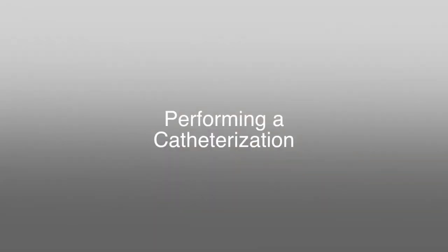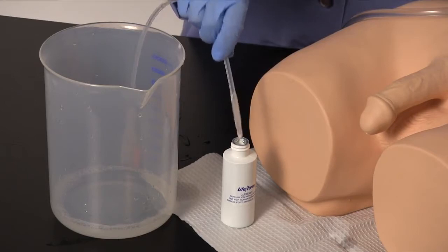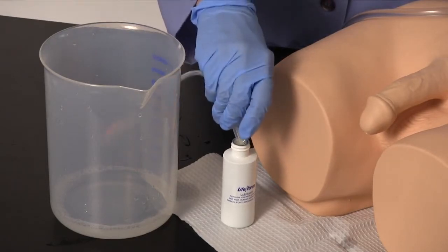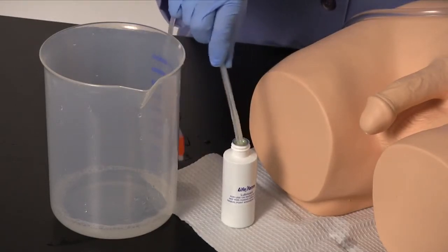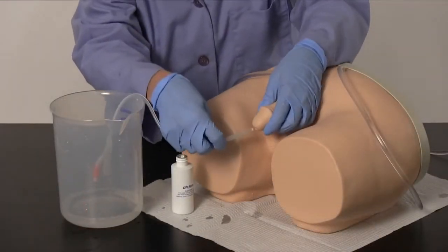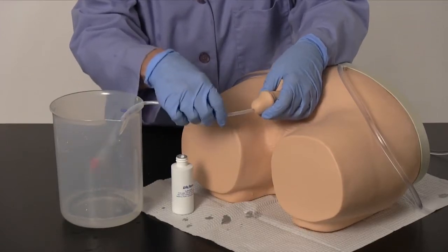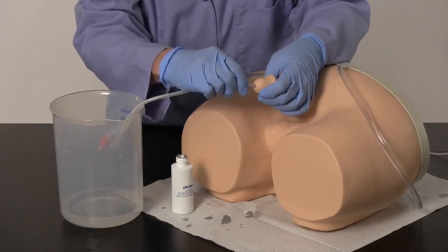Performing a Catheterization. Retain a water-safe basin or catheter bag to catch the water upon successful catheterization. Start by generously lubricating a 16 French silicone Foley catheter using the supplied Lifeform lubricant. In the normal hanging position, gently insert the lubricated catheter. Gently elevate the penis 60 degrees to straighten the urethra and proceed with insertion.